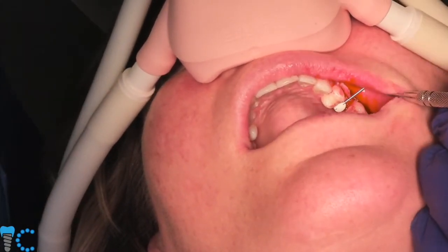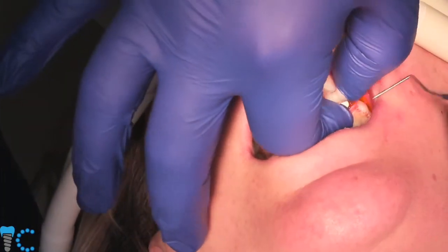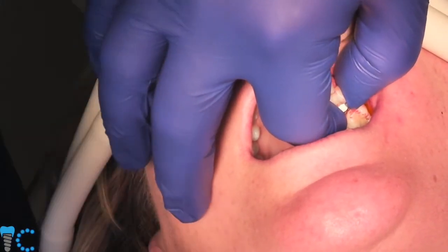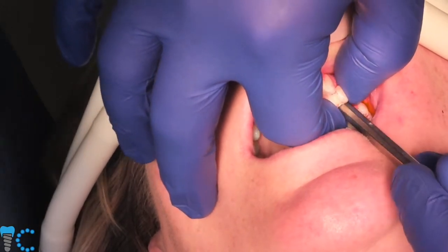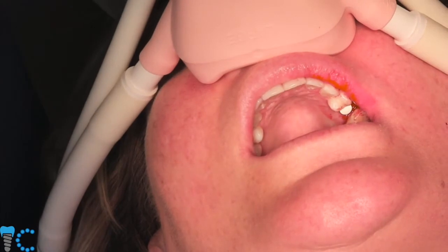So put the cap in. What kind of surface is on zirconia implants, Z-Systems implants?